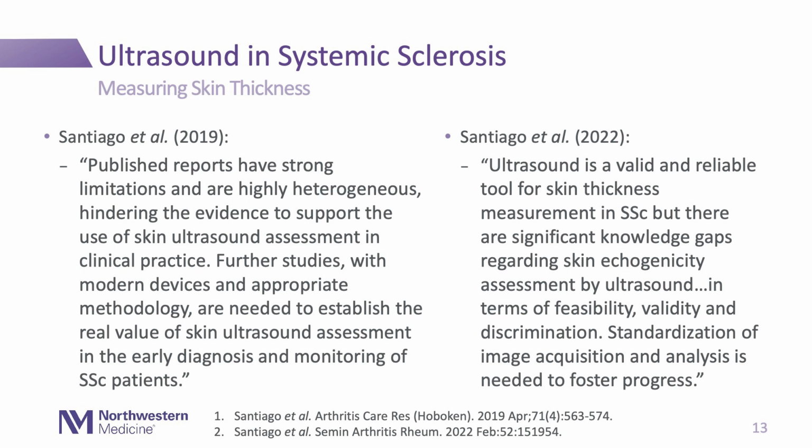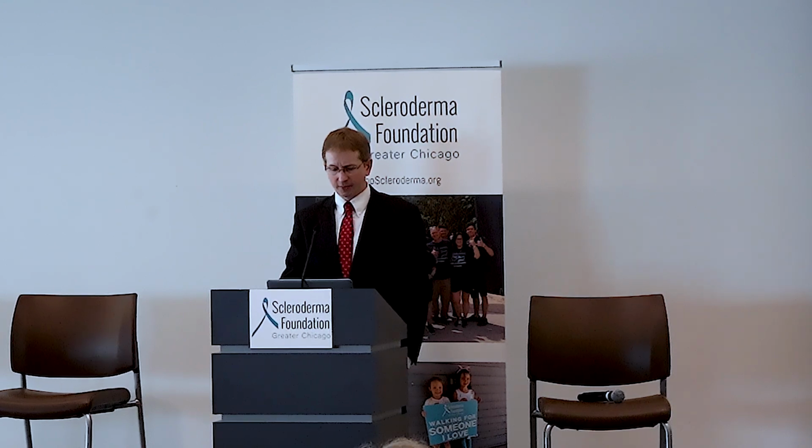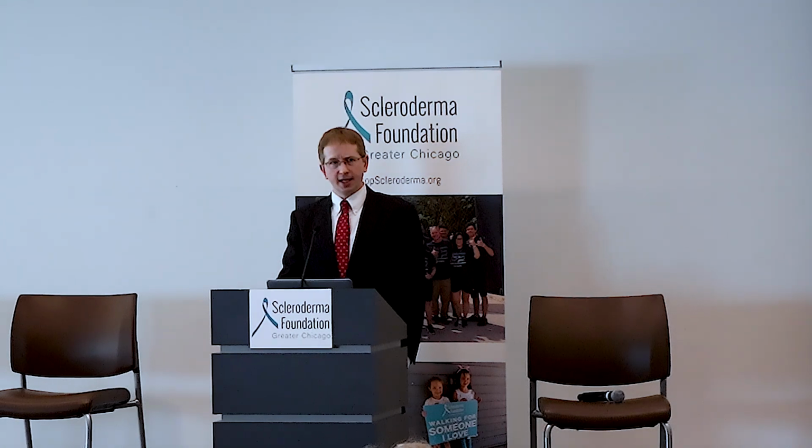I'll just draw your attention to this: we know we can make measurements, but there's the feasibility, the validity, and the discrimination, meaning is this diseased or not diseased, making those thresholds, deciding what the cut points are for saying abnormal or not abnormal. And then also the question of is this clinically meaningful? It's going from a 0.3 millimeter improvement versus a 0.08 millimeter improvement. What does that mean for a patient? No one's looked at that in a bigger sense. So essentially, there's promise in the technology, but there's still zero standardization right now, so it's impossible really to compare study to study.